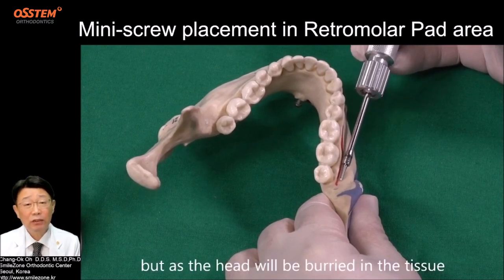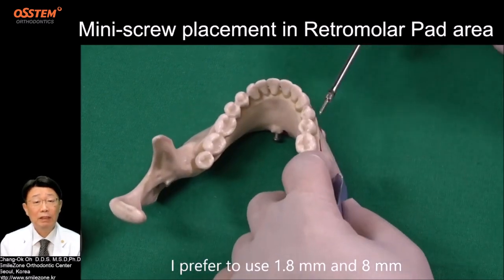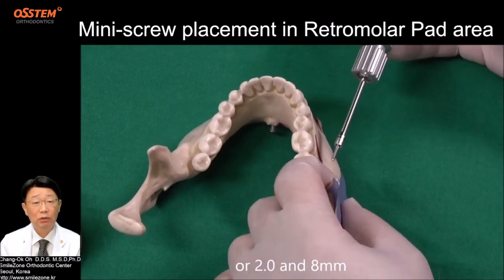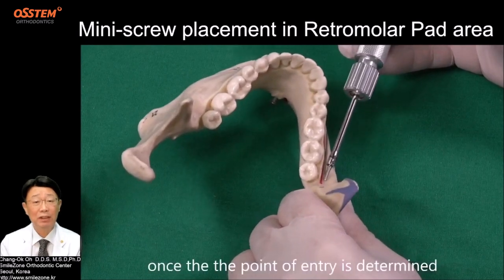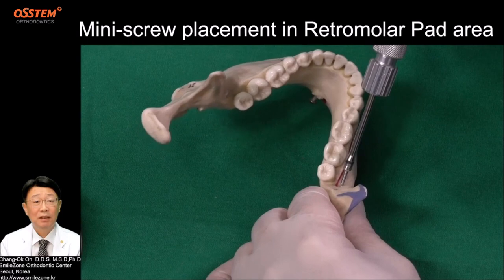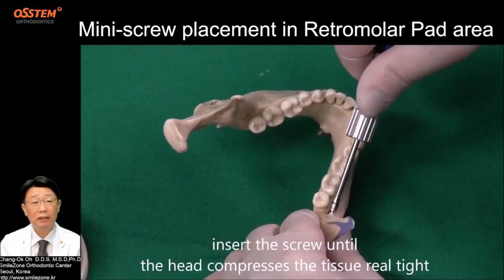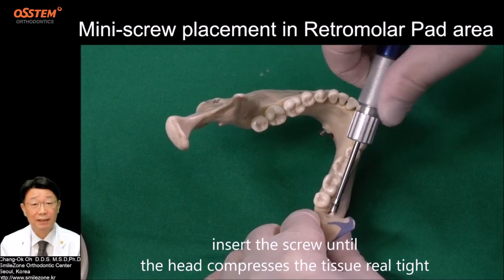But as the head will be buried in the tissue, I prefer to use 1.8 mm and 8 mm or 2.0 and 8 mm. Once the point of entry is determined, insert the screw until the head compresses the tissue real tight.